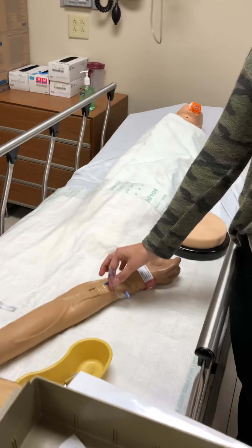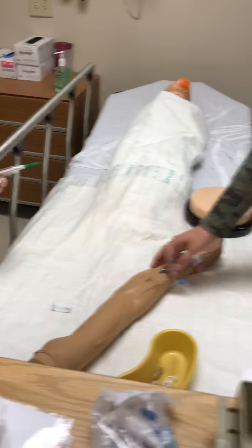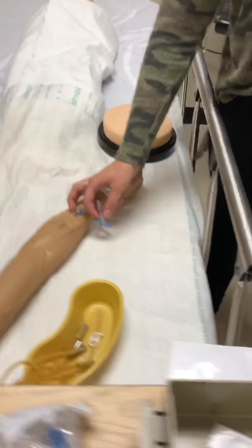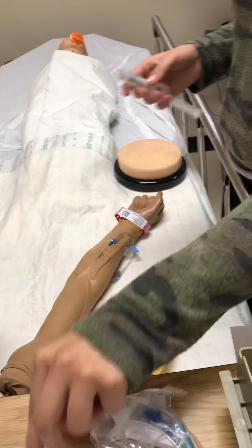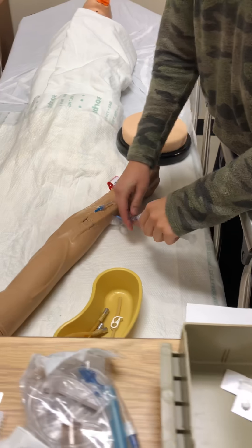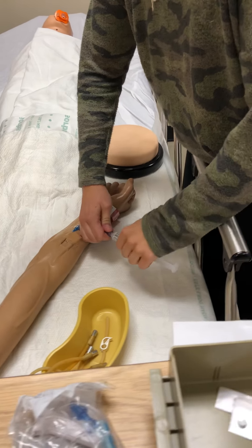We need to do a saline flush — oh my gosh — before and after, because he's not continuously getting an IV. So we just have to automatically know that. We have to bring our saline. Don't forget that. You scrub for 15 seconds. How much saline are you going to put in? She said it doesn't matter — so like you have this 10 milliliters. She said you could do five before, five after. And you would do this after performing. We already did one, and then you cleaned it.